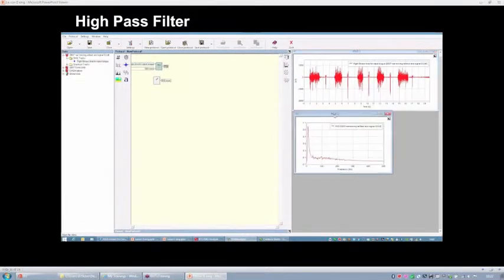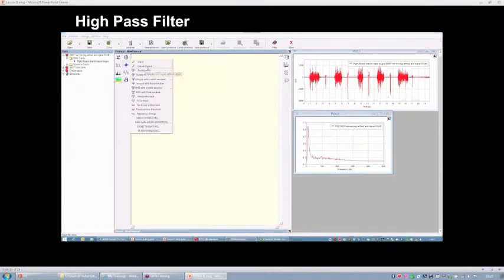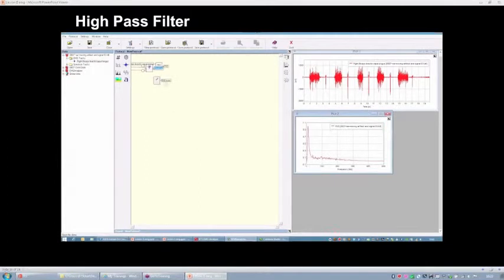As you can see from this spectrum, we have a very big contribution coming from the low-frequency moving artifact. So now I want to show you how you can filter a signal like this to remove the low-frequency moving artifact. I'm going to use, for example, a Butterworth high-pass filter algorithm. The first thing that you have to do is to define the cutoff frequency. So you have to define a fixed input. I'm going to choose 30 Hertz, for example.